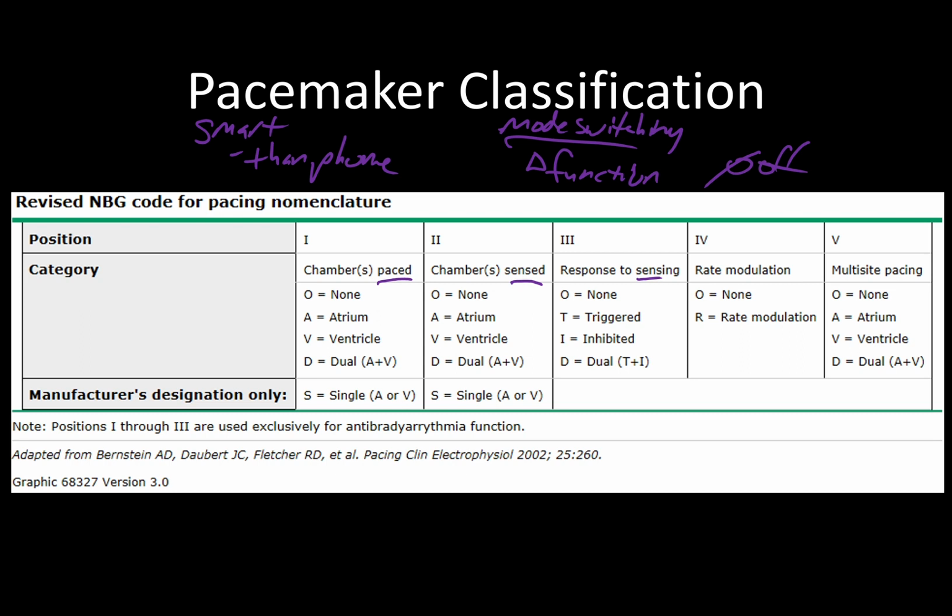And that's a really cool thing. The other neat thing that it does is something called rate responsiveness. And the reason why that's cool is it actually changes the rate based on what the patient's trying to do.